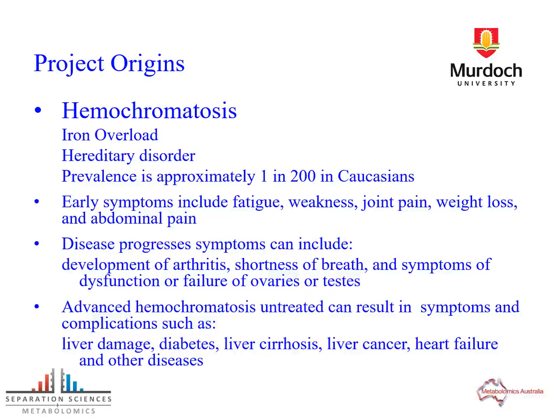Now, we were contacted originally by a gastroenterologist to develop a method to measure hepcidin 25, the 25 amino acid form, in urine. Certainly when we started this research back in 2006, 2007, the majority of people were making measurements in urine rather than blood.